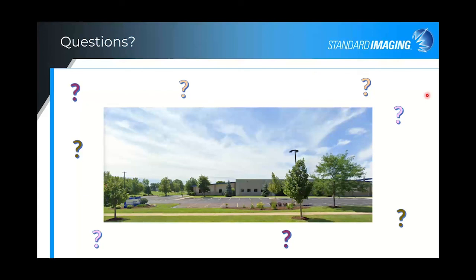Of course, I think I gave some examples early on about papers that were doing detector array comparisons and showing how a lot of small errors could be determined using detector array comparisons. Of course, there are multiple articles that you could review. So I think that's all the questions. I hope that was clear.